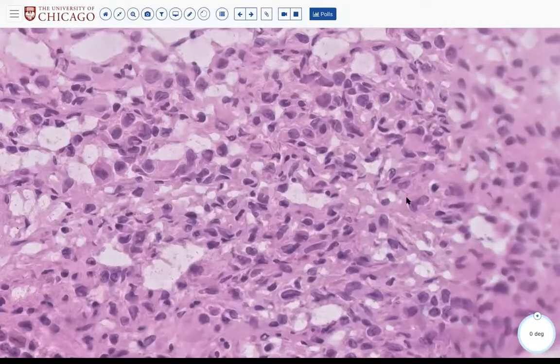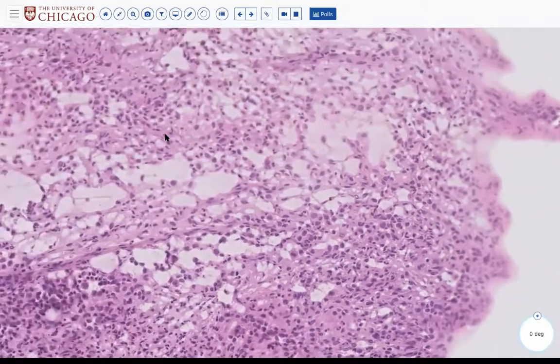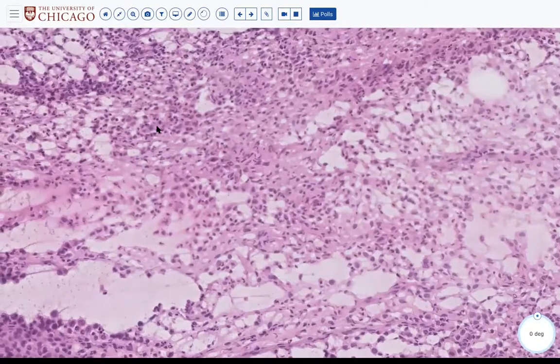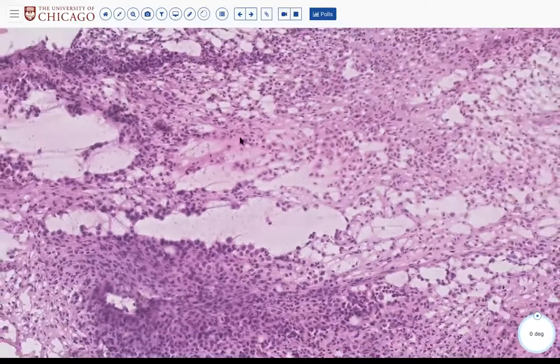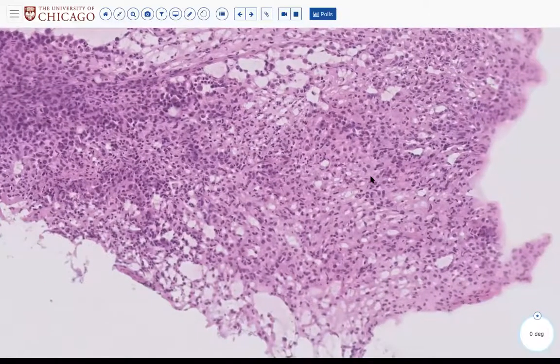Round cell tumor. Not some sort of histiocyte. Ewing. So we have a couple of votes for a round cell. I'm going to include round cell and Ewing's together. Then we have some kind of histiocytoid lesion on the differential.